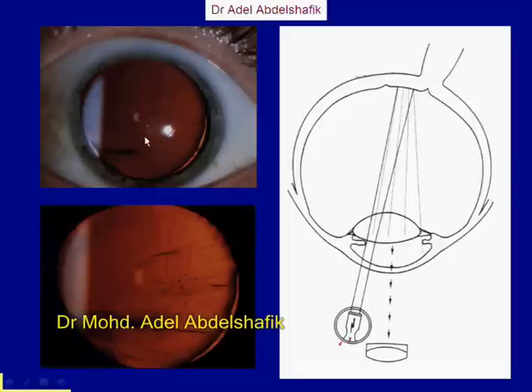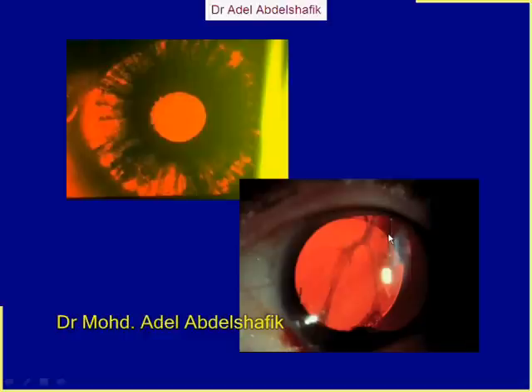Another example here, we get some lines here, and what is this? This is the edge of the lens. Again, this is the retro-illumination. We are illuminating back and seeing something forward. Again, you can see here a reflection of the iris. You can see a red reflex here.